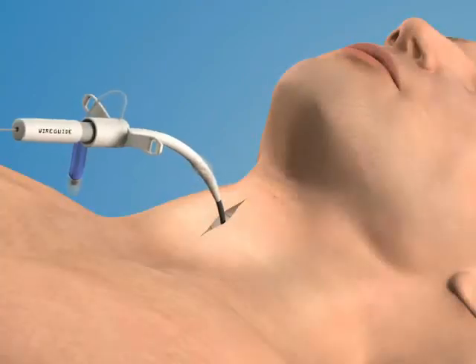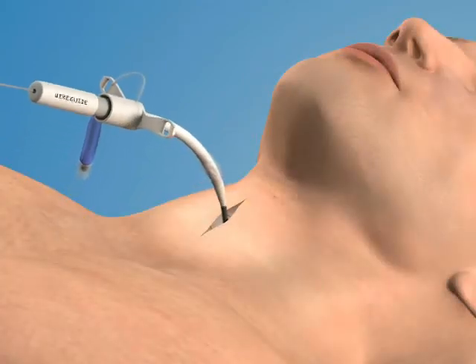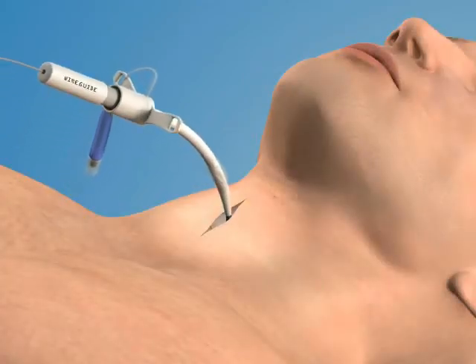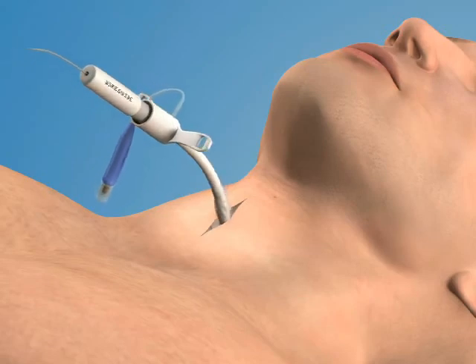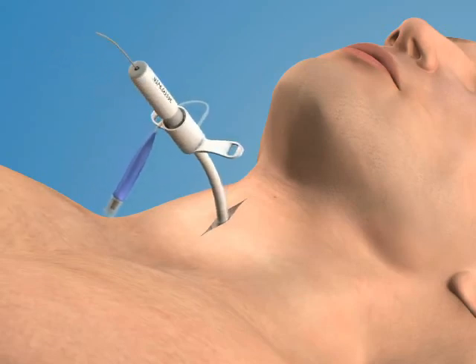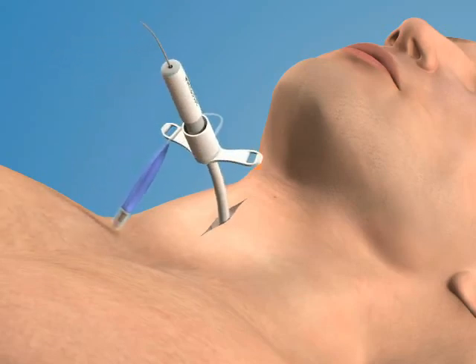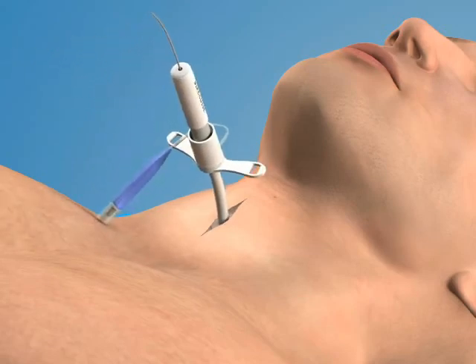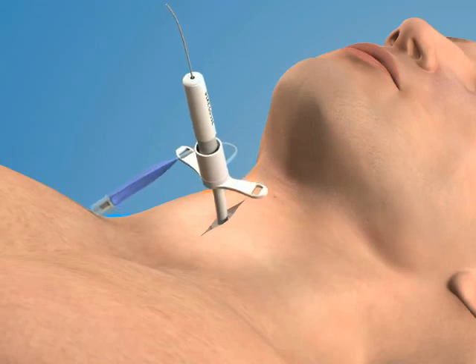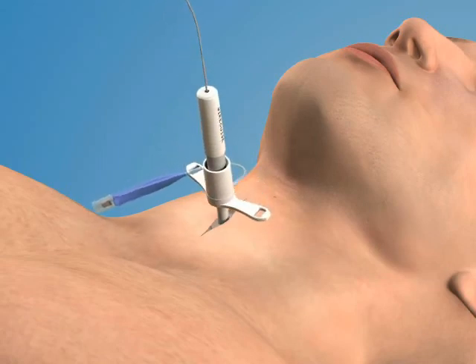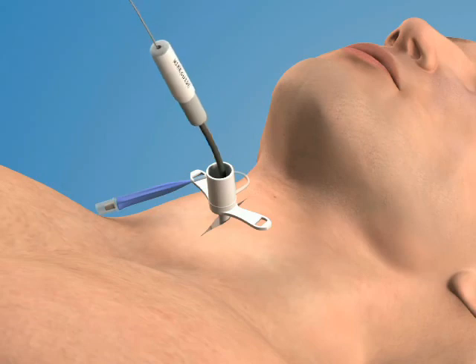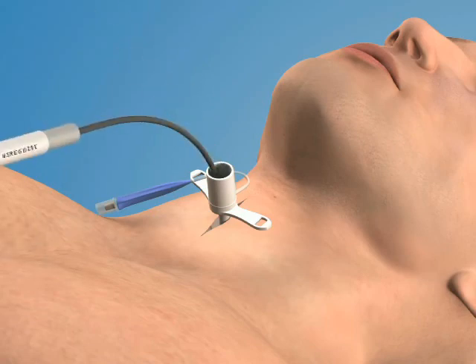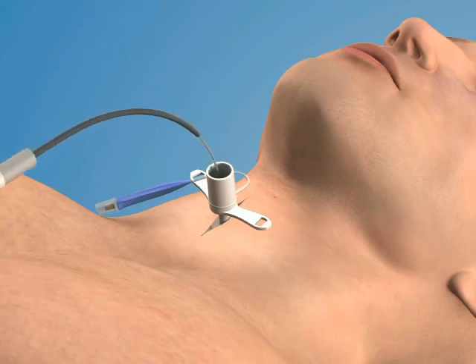Advance the dilator and the airway catheter as a unit into the trachea using a reciprocating motion. The hub and flange of the catheter should be flush against the skin. Simultaneously remove the guide wire and the dilator from the catheter.